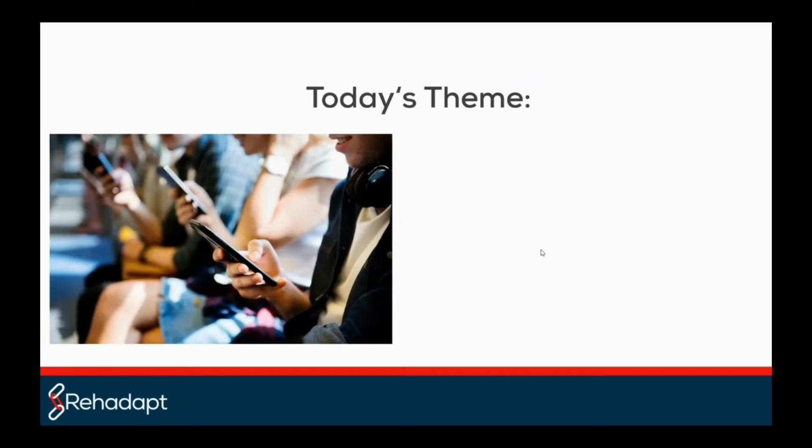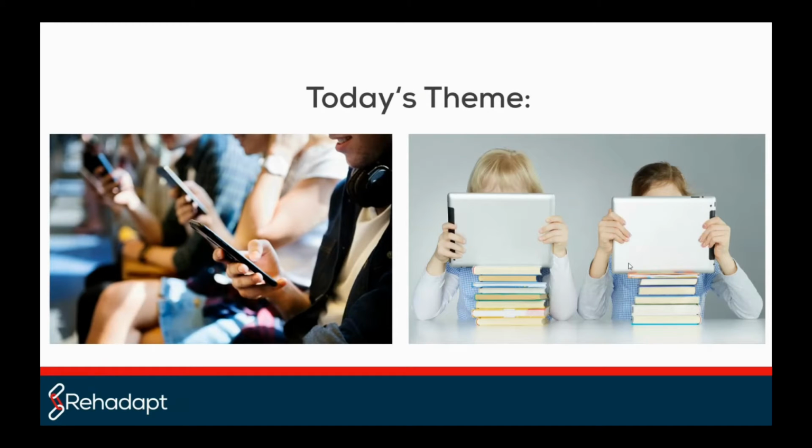I think everybody more or less knows how important it is nowadays to have the opportunity to use tablets, communication systems successfully for our daily routines, such as just checking our emails, being able to use social media platforms and all of that. But also for our customers with cerebral palsy, ALS, MND diseases, or all different kind of various demands.